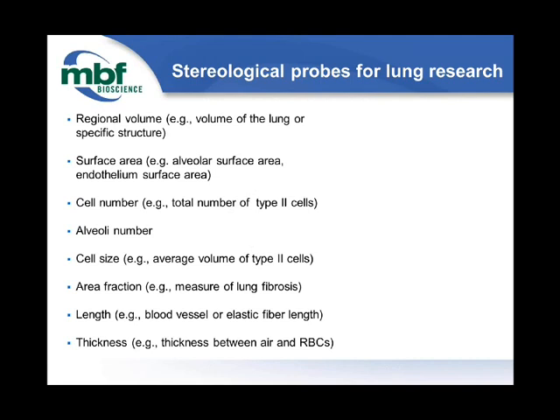Now, all of this data has stereological applications, there are stereological probes that can be used to get this data on either thin sections or thick sections. I'm not going to go into the details of which probe to use for which, but we can definitely help you out with that.